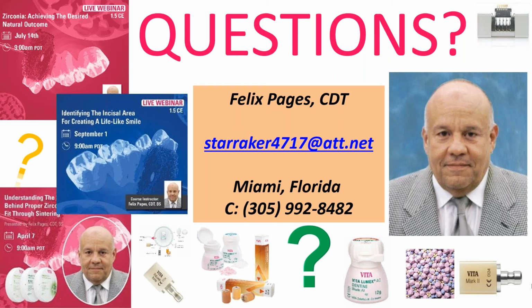Let's just say that you had tetracycline stain or West Texas teeth, and there's no way that you could get the color out. Then you would need something to block out the color. And that would be where they would say, maybe I can use a zirconia veneer there to block something out. I don't know. I've seen one and I had to do it over for the doctor.